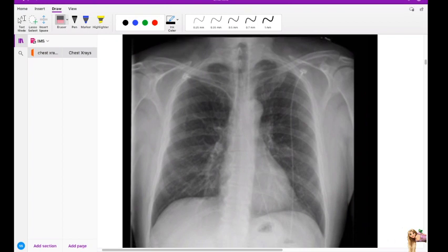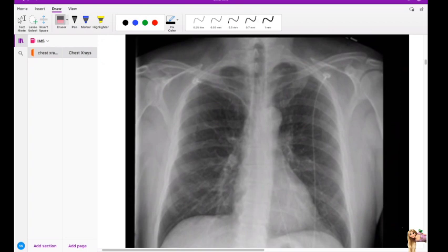You can see, even though you don't. Can you see though? That's for real. Yeah.